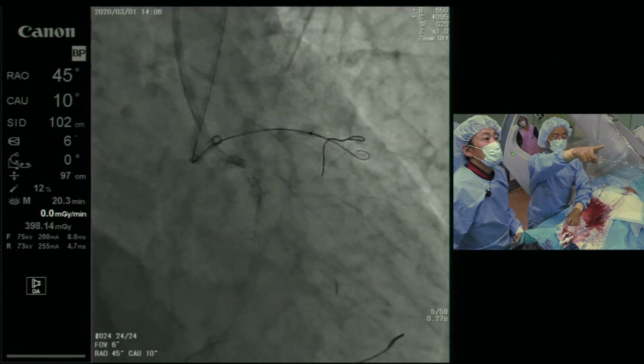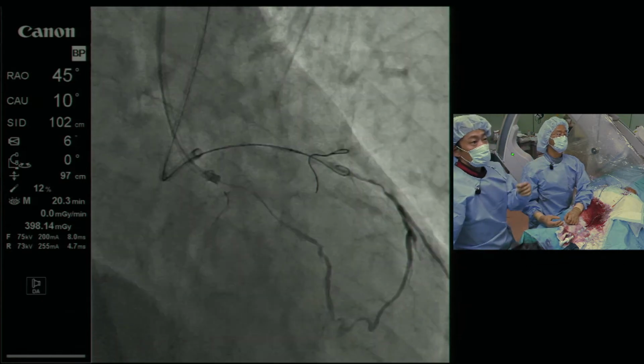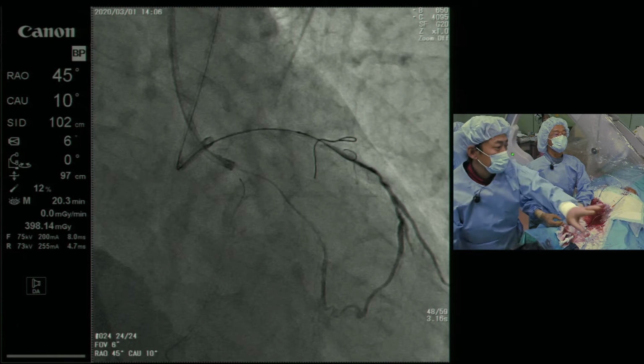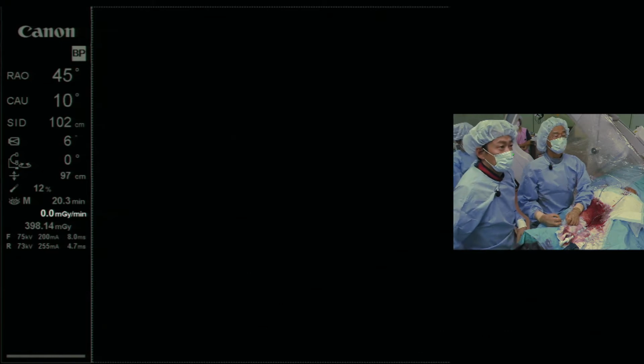And this can be followed with a softer catheter, but I think the operator still wants everything to be done antegradely, and even if the antegrade nipple was not seen so well, it was good to take the help of the IVUS and puncture with a wire with slightly higher tip load, but now shifting to a wire with a lesser tip load.